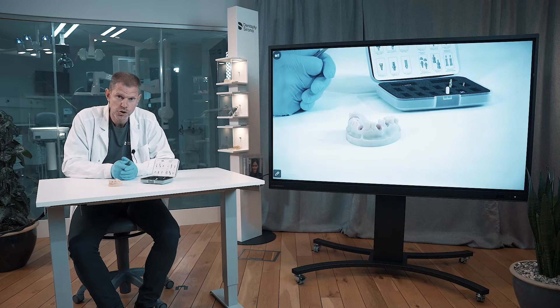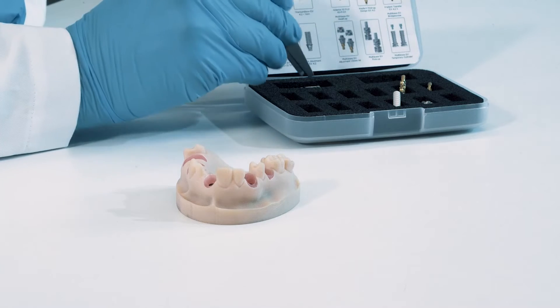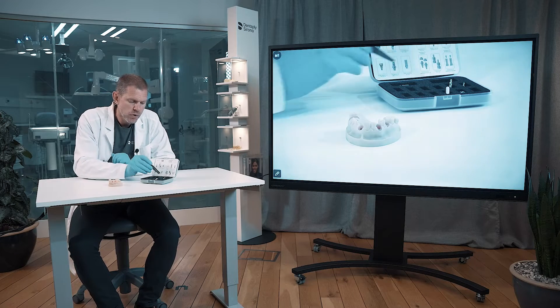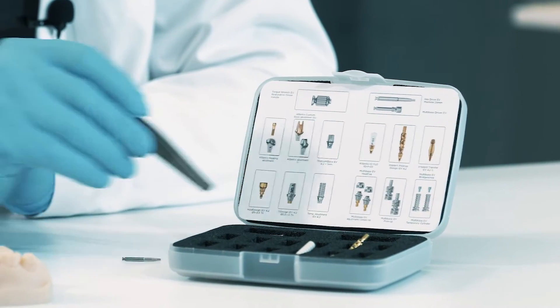First of all, to handle the majority of all these products in the box, you need this driver handle that you can see here, as well as the hex driver that we have here. So I put them together first here.